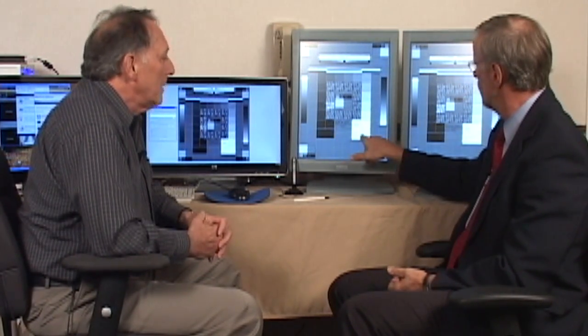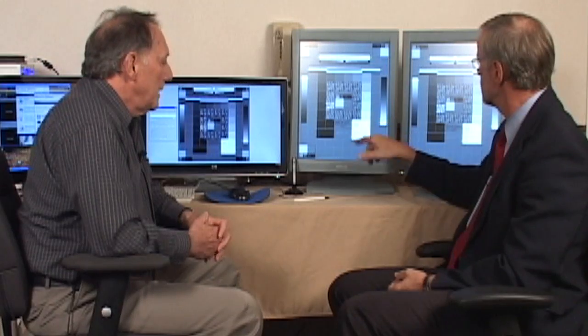And just like any radiologist has done in the past with film, if you got a very bright spot in the film, they take out a piece of paper from their back pocket that's black and cover up the bright areas so they can see the darker areas. So if you want to check quickly whether your monitor is totally out of calibration or not, you start off with, can I see quality control, those 3 blocks, and then look at the corners, and it should give you already a good indication, right?